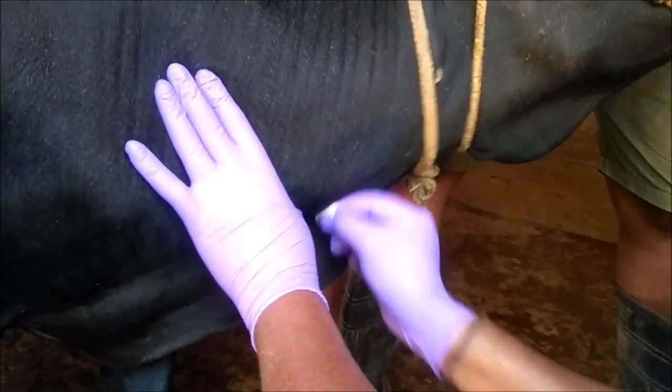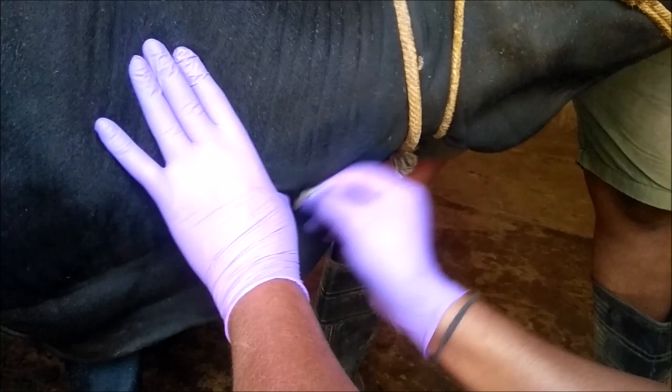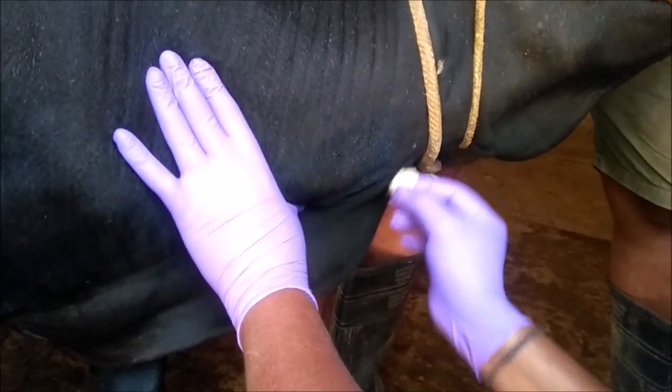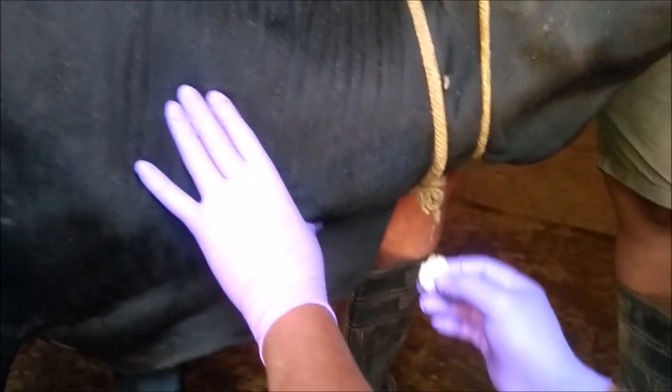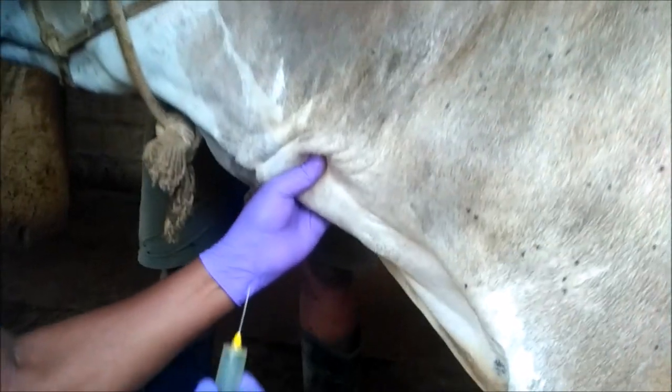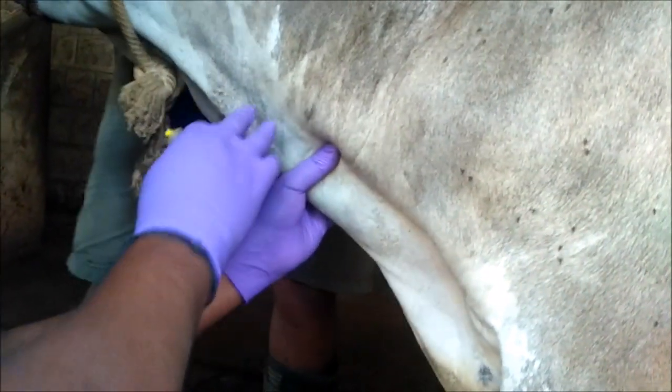Once the animal is restrained, try to clean the jugular groove or the place where the vein runs. Once cleaned, press the jugular groove so that the jugular vein rises.